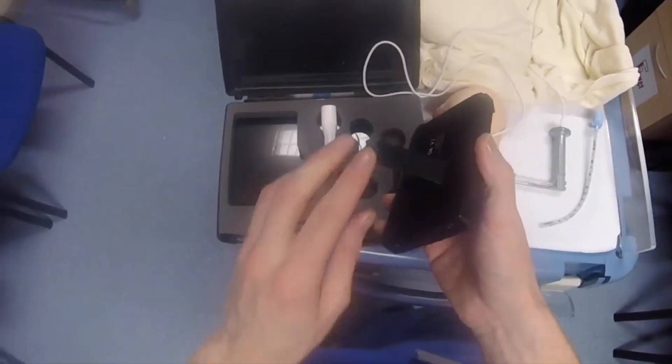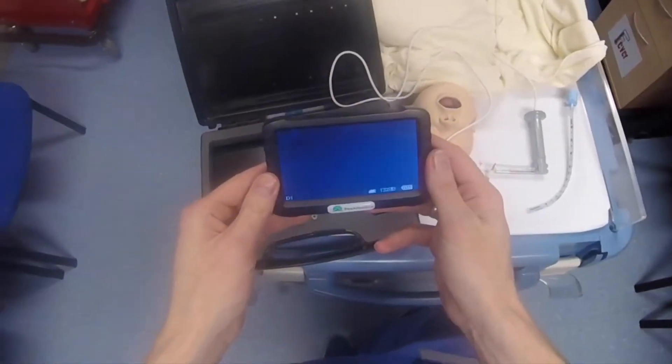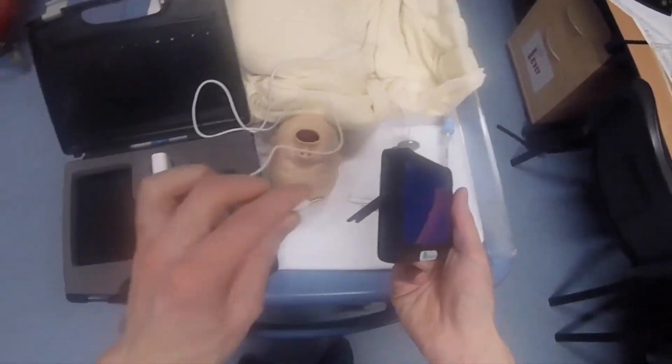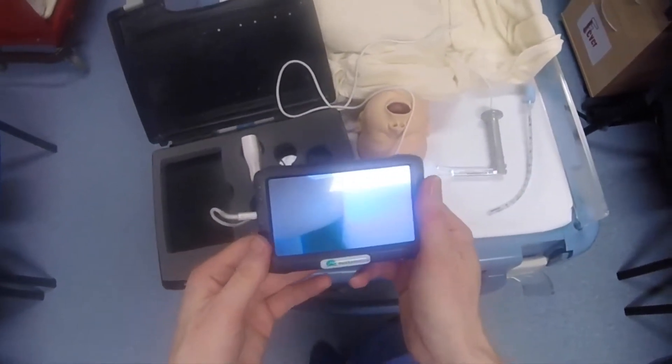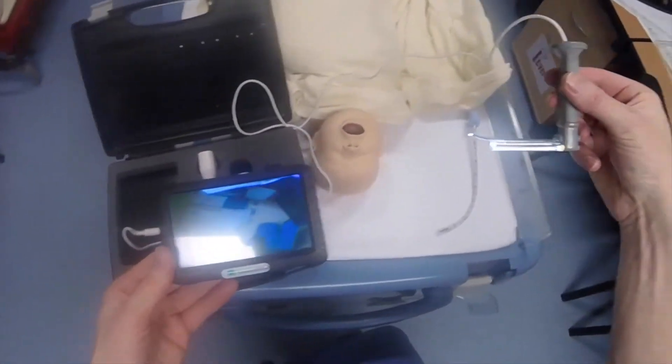You can pull this clip out and then you've got a stand to hold the monitor up. The video baton just plugs into here, and then you've got the image displayed on the screen.